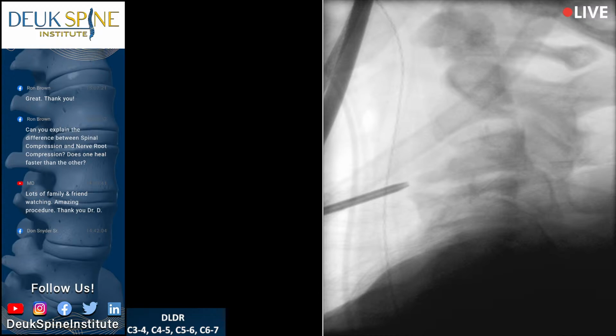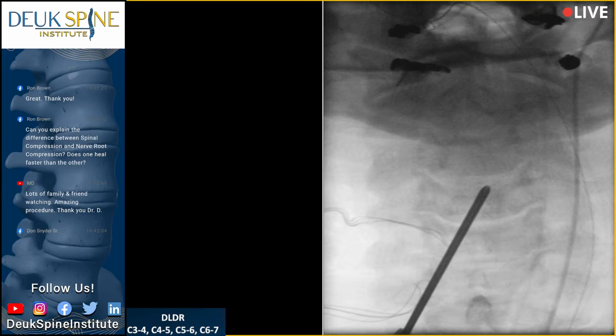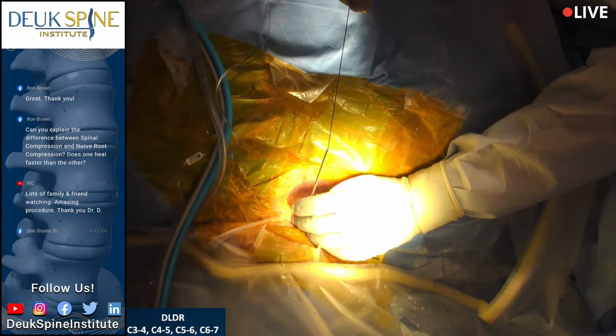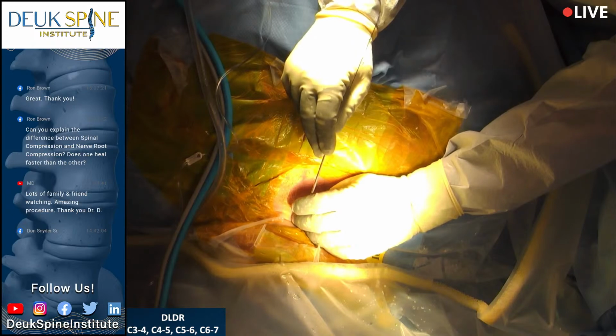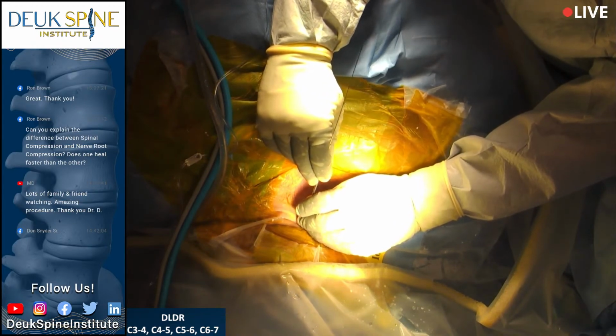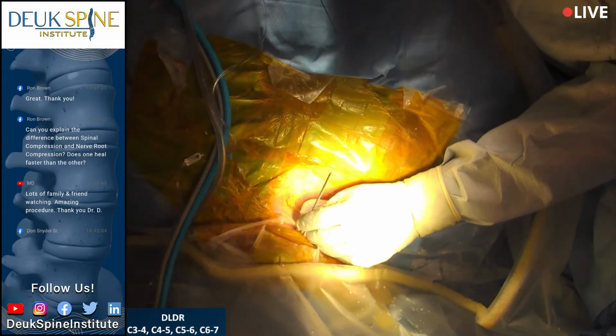I'm on what feels like the disc, but I can't tell if I'm midline or not. Let me know when you're ready. Shot. That looks pretty good. Wait. Let's try that. Hold on. Shot. That's even better. Yes, it's better. Give me a lateral. Let me have the pipe cleaner. Shot. Let me have a mallet. Shot.